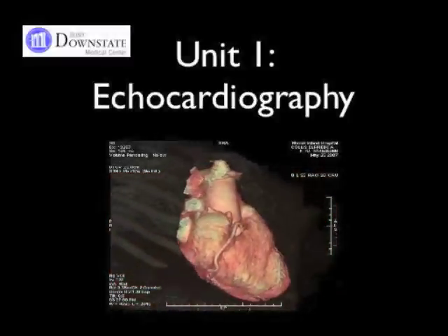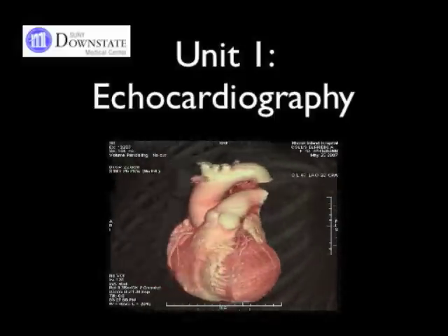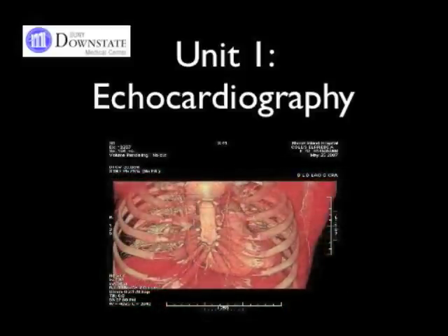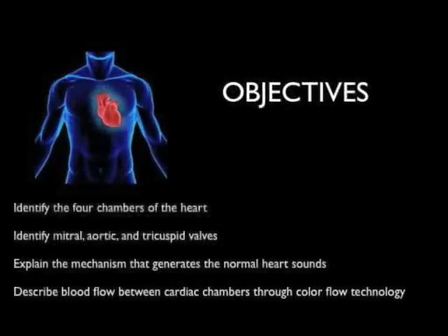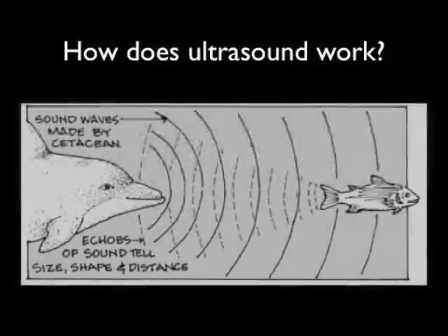My name is Dimitri Papanagnou, attending physician in emergency medicine at SUNY Downstate and Kings County Hospital, and the director for medical simulation. In this module, we're going to use basic ultrasonography to better understand the cardiac examination during the physical examination. This module is not an ultrasound training module. Rather, we're going to build on concepts during the cardiac exam in identifying the four chambers of the heart, identifying valves, explaining the mechanisms that generate heart sound, and using a few modalities to understand blood flow.